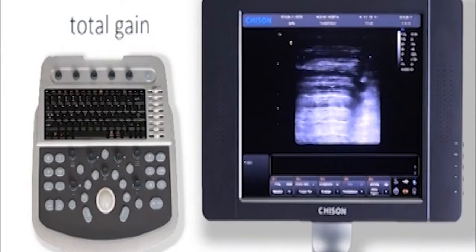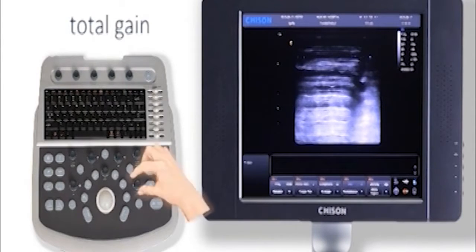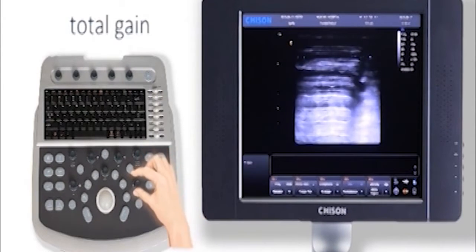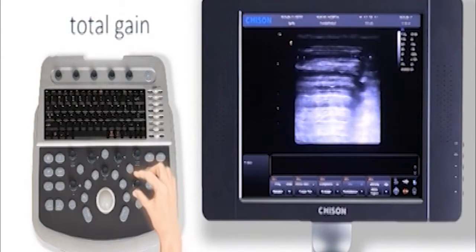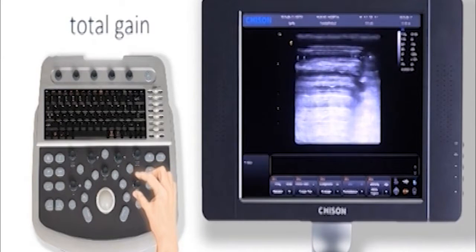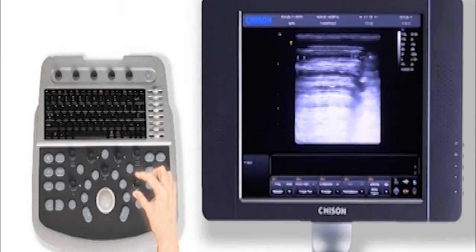To adjust total gain, rotate the B knob. You can increase or decrease gain. Make sure the image is not too bright or not too dark.